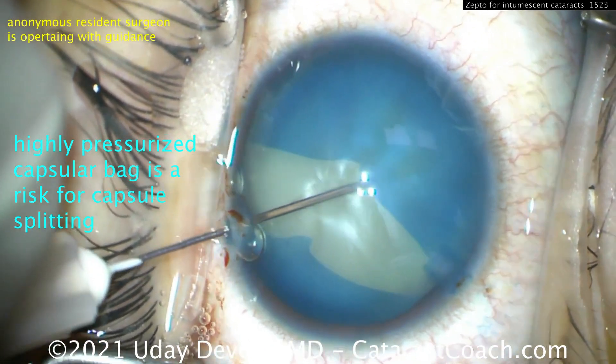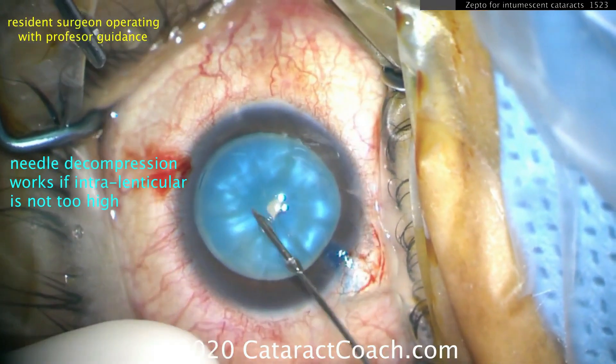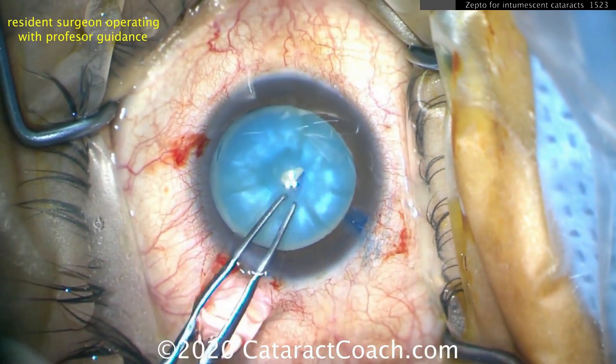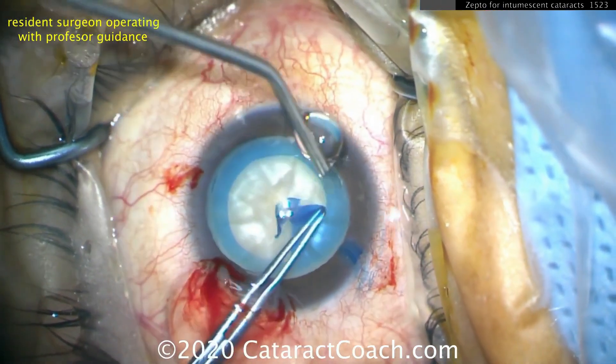So I poke it with a needle, and look what happens. What we want is a needle decompression. That works if the lenticular pressure is not too high. And you can see in this resident case, able to decompress the capsular bag and then create the rhexis.